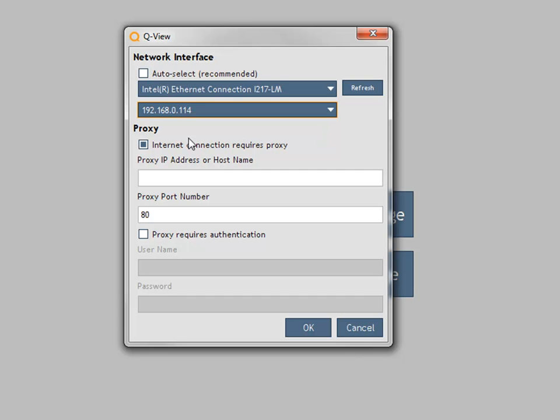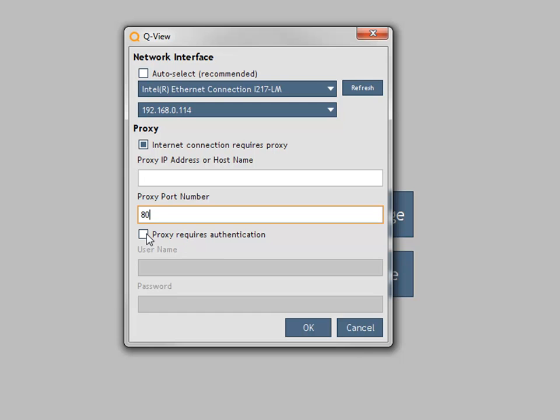If access goes through a proxy, click the Internet Connection Requires Proxy checkbox and enter the IP address or host name and associated port number. If your proxy requires authentication, enter the username and password.